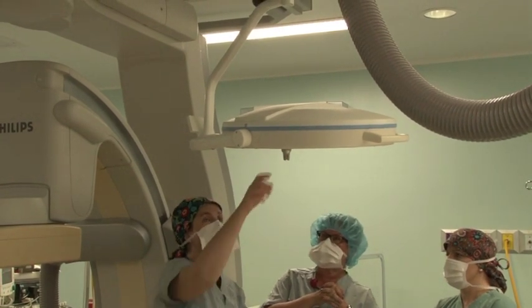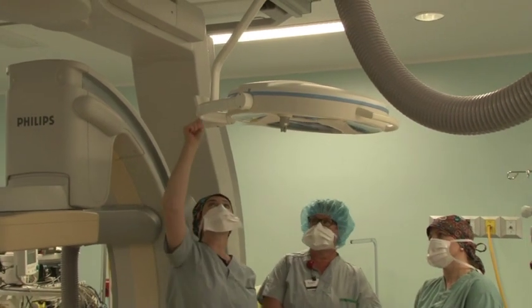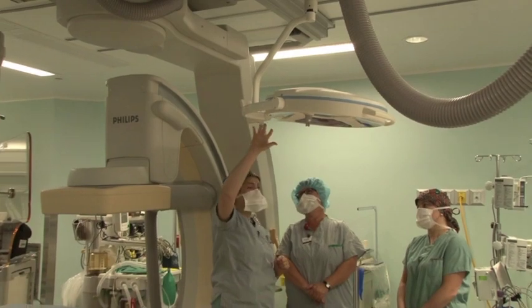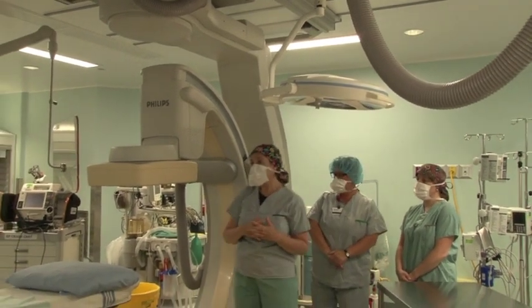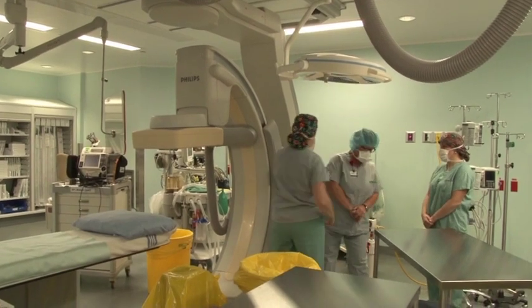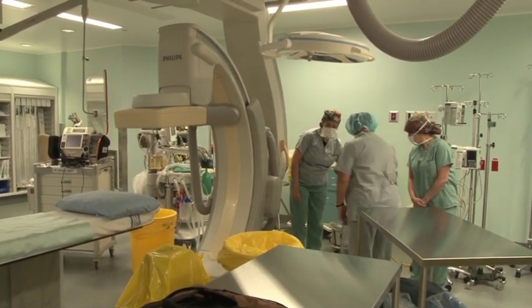Dr. Toll wants to position his light, we do have handles for him now, but the big thing would be for us to turn it on and off, and it's clearly marked here on and off just on the side. Two days a week, we do have an anesthetist assistant here assisting us, and he will be standing behind here with the patient.